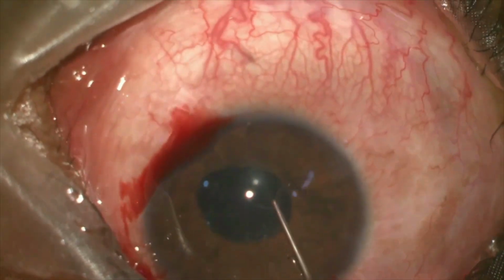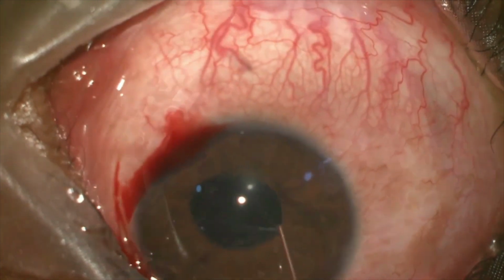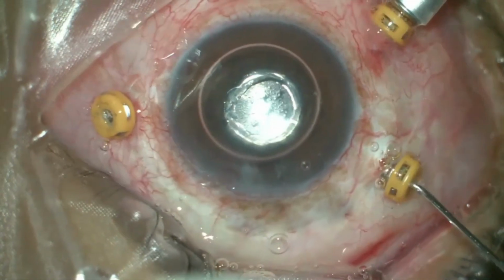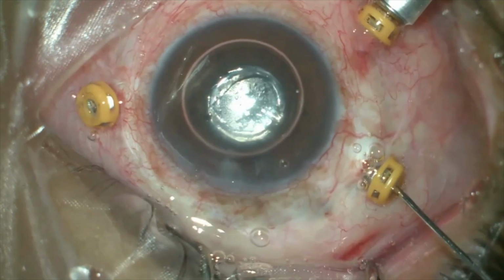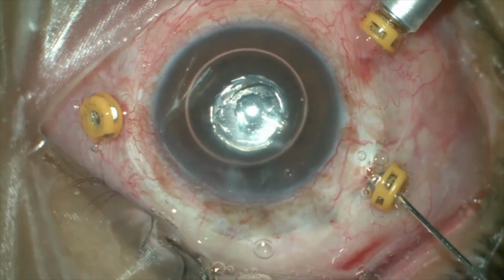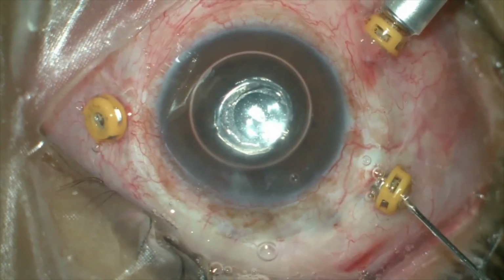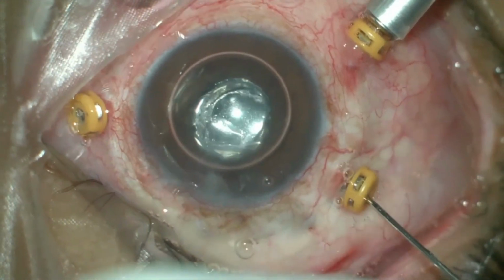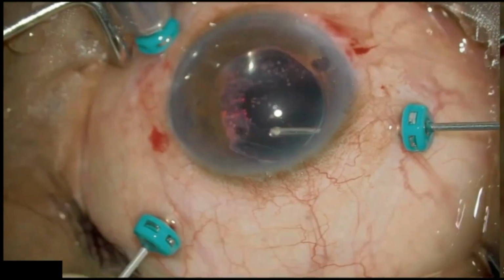If pupillary membrane is there over the IOL, it needs to be cleared to get proper visualization. Intraoperative fogging of IOL can be tackled by coating the posterior surface of the IOL with visco. In cases with significant PCO, we can create a PC opening with the help of cutter.